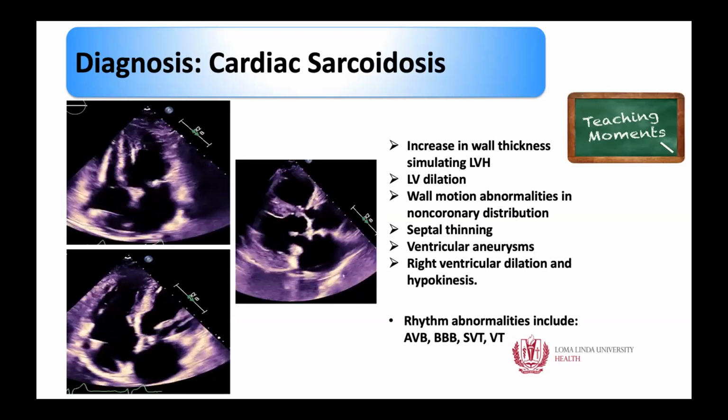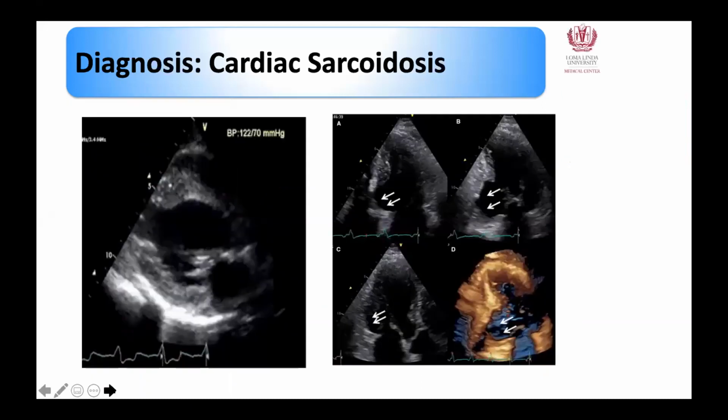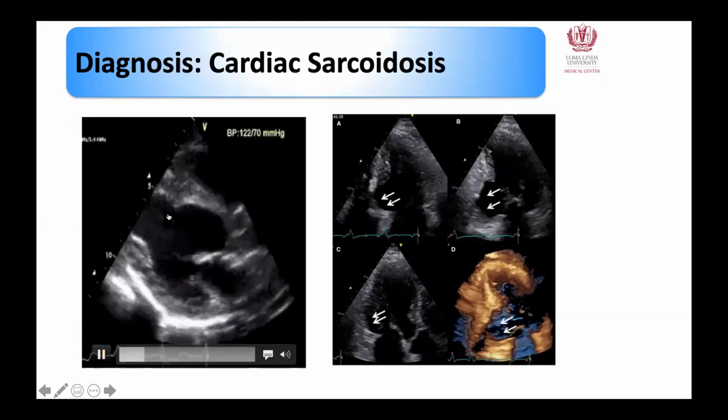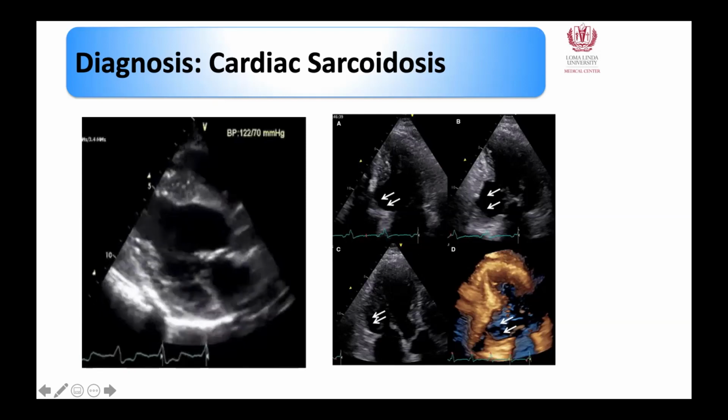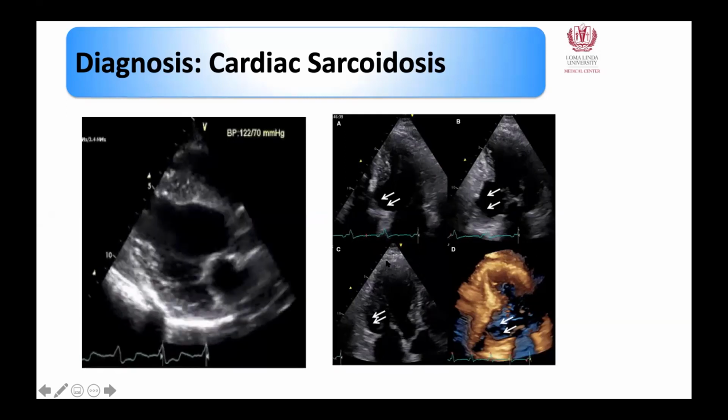So let's see. I have some slides on ARVD as well, which I'd really like to finish, but this is another example. So here you have a clear-cut aneurysm of the basal septum, and again this can also involve not just the basal septum but also the inferior wall. So this is inferoseptum aneurysm, this is the inferior wall aneurysm, and you can see this on the 3D right here. So just keep an eye on the planes that you are scanning this patient.